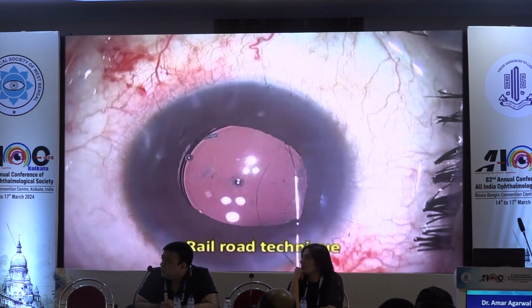They'd be 6/12, very good. I'm very happy. From counting fingers at 1 meter to 6/12, the patient is jumping. Can I make him 6/6? Then I began to understand, if you have higher order aberrations higher, the pupil will have to come smaller. I said normal is 0.3.